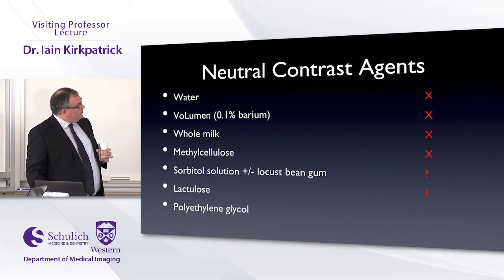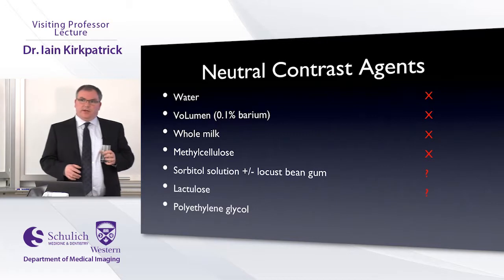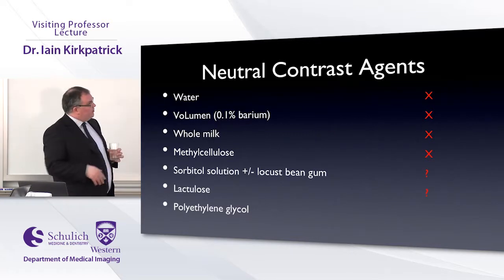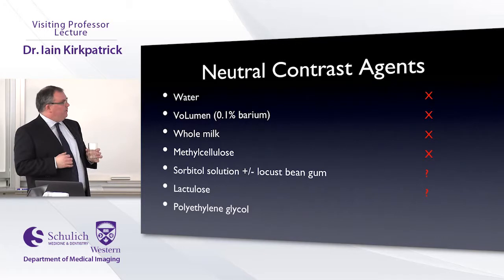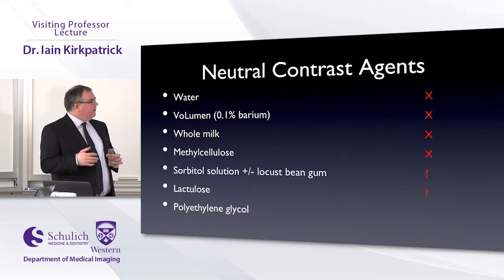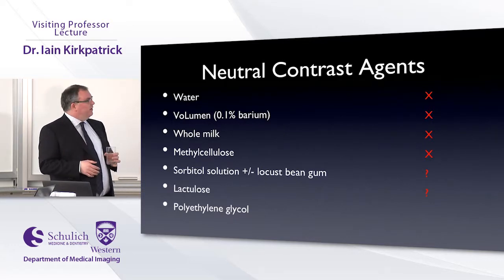I would say that lactulose might be a good solution. There was actually a paper in the CARJ a couple of years ago saying that of all these things I show you here, lactulose actually gave them the best distension, and they recommended it. And after I read that paper, I thought, well, this sounds great. I'm going to try lactulose for my CT enterography. So I called pharmacy. I said, I'd like to get some lactulose, please. I'm going to try this for my CT enterography.